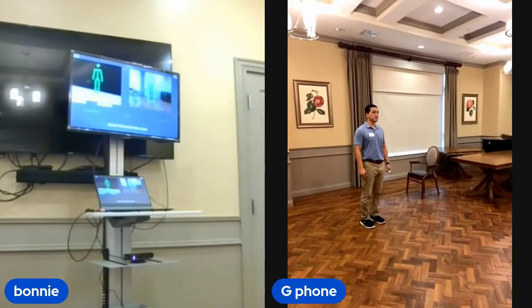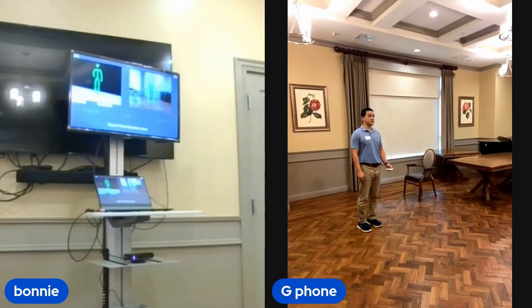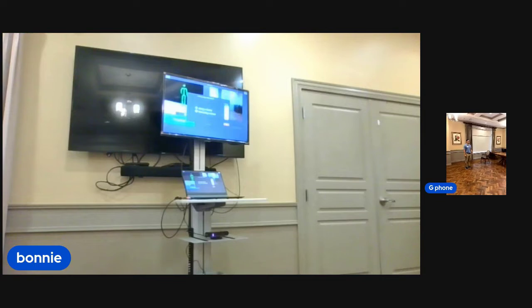Okay, so they're going to be favoring their left. They just had a right hip replacement. This is what it hopefully will look like. Stand 14 feet. Nice. Okay. Start. Not using the device today. Start the short step. Yes.